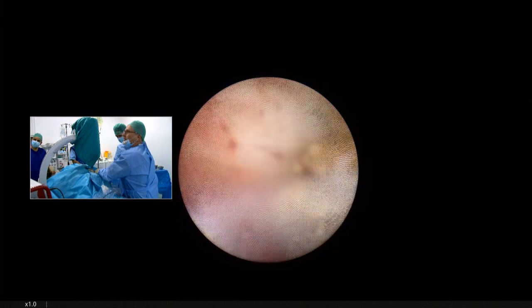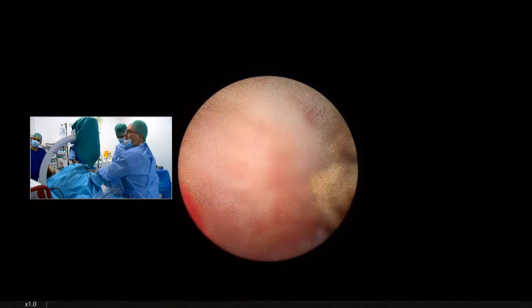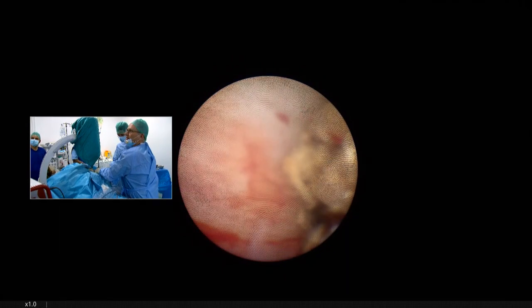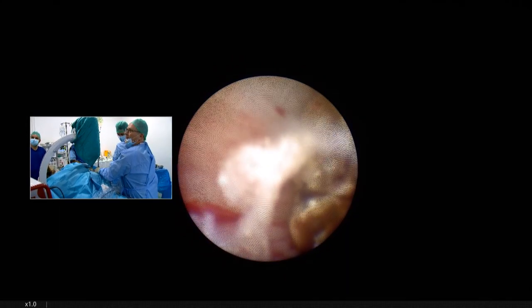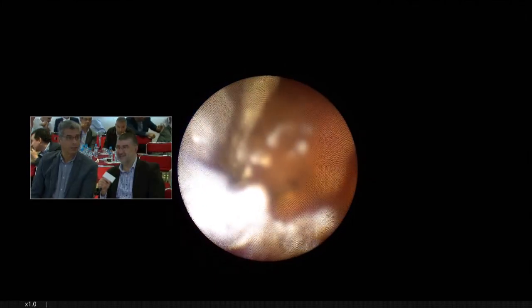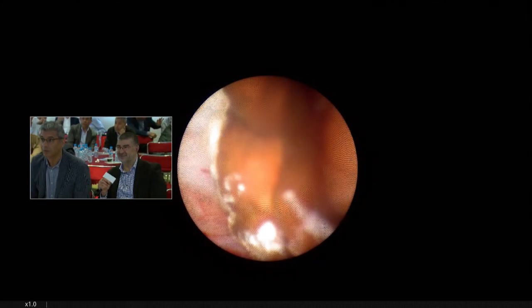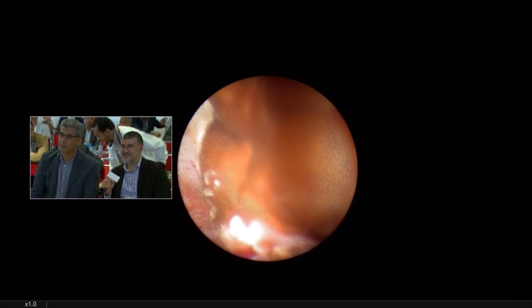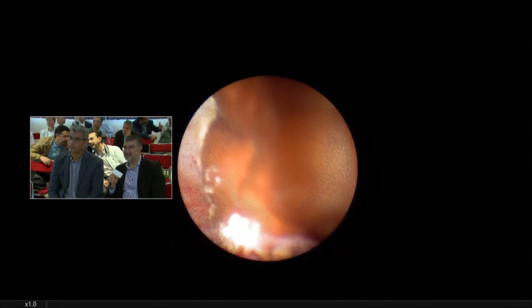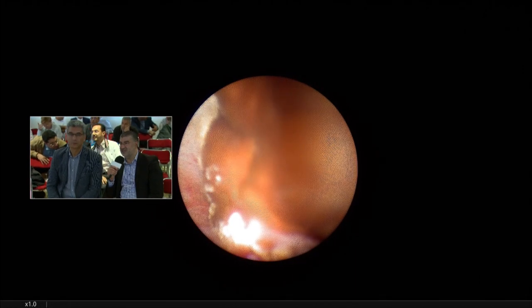Yes, yes, we see the stone. Okay. This is the second remaining stone. Laser is okay? Yes, yes, we see the stone clearly.